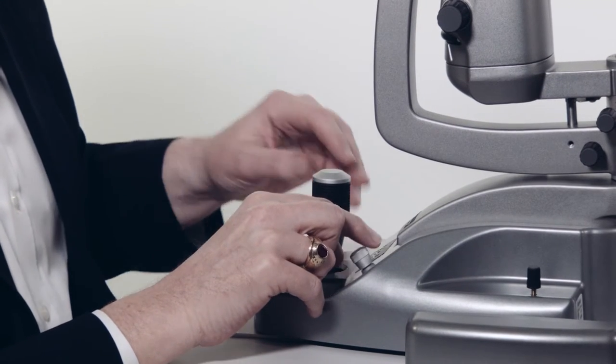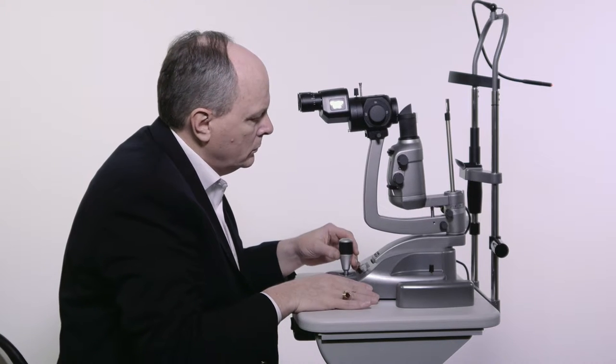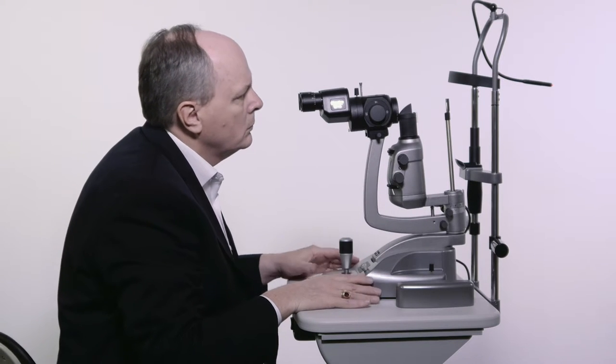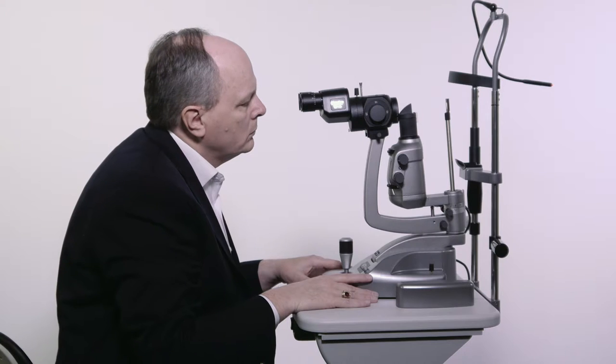Rotate the joystick until the light beam is at eye level. Move the slit lamp towards the patient until the slit beam is focused on the cornea.